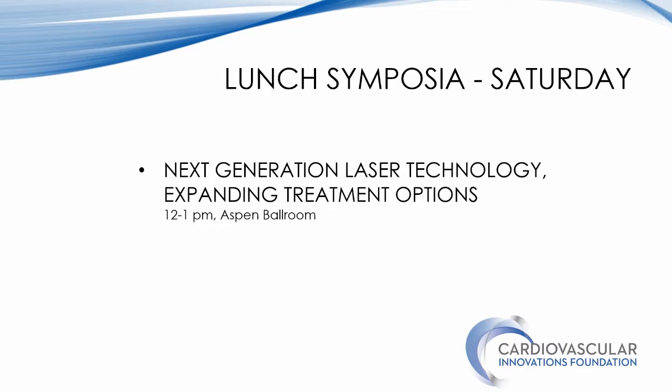So I think sizing is really important. I don't use IVUS. I will use stent tape almost in every one of these cases. I don't think that's always the most accurate, but I'll get an idea from that stent tape, and I usually start with underinflation to dilate one of these lesions. So it's very common to start with a 4 millimeter balloon and then go back up to whether a 5 or 6, and then from there decide what I want to do.